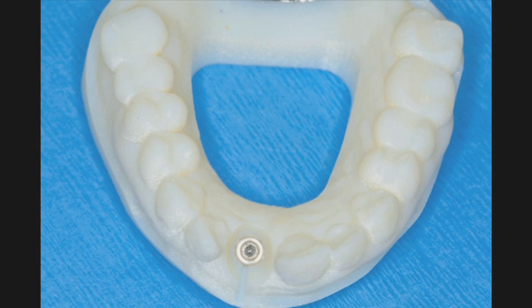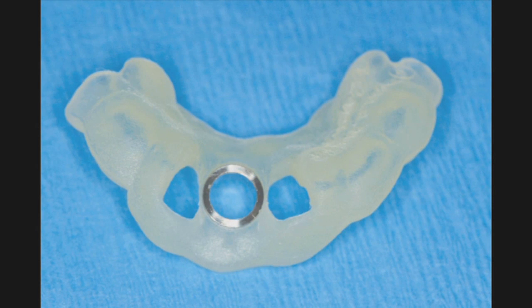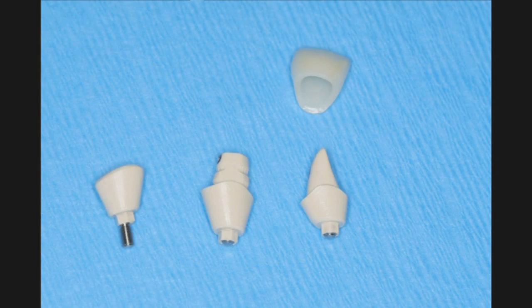Once virtual placement was determined, a computer-generated model was fabricated. Again, a surgical guide was created to position the implant correctly. We would then do a flapless procedure, placing the implant following extraction of the central incisor. Figure 6 demonstrates the use of the inclusive tooth replacement solution, and a custom milled healing abutment, temporary abutment, and impression coping were fabricated along with the biotemp provisional crown.